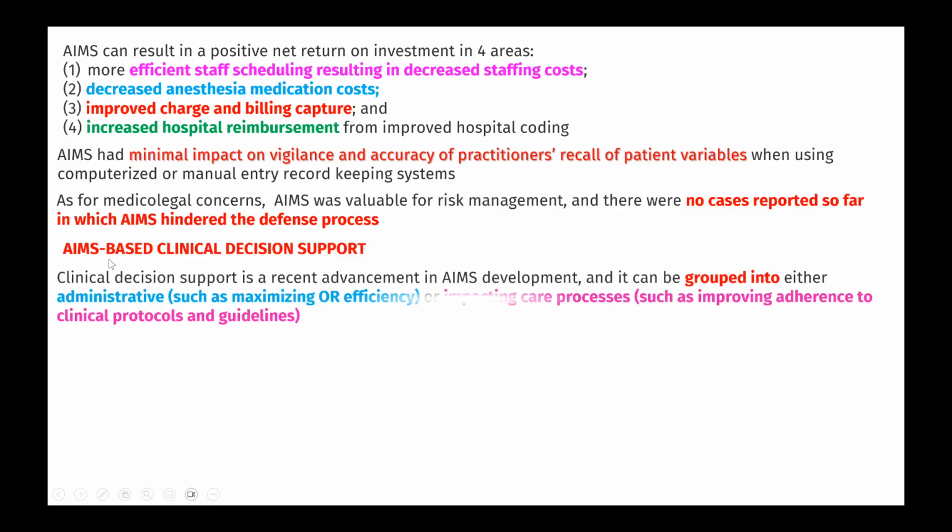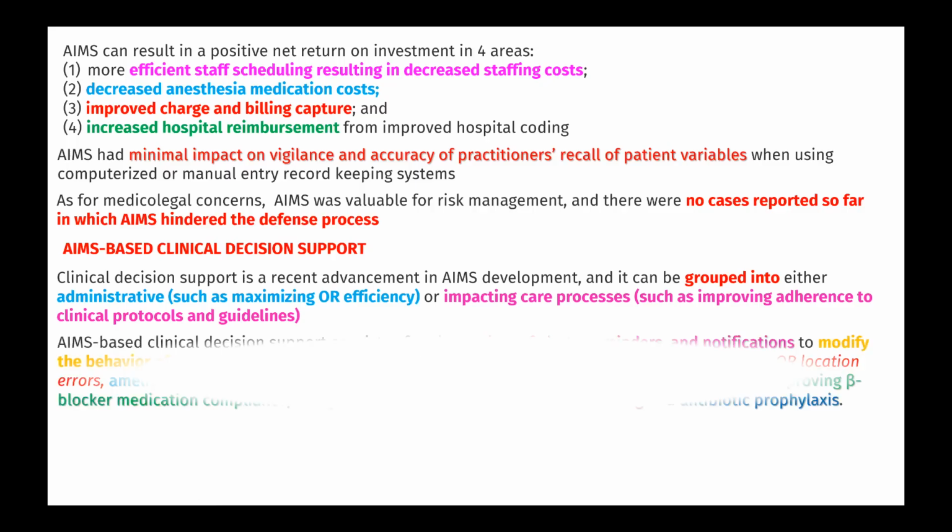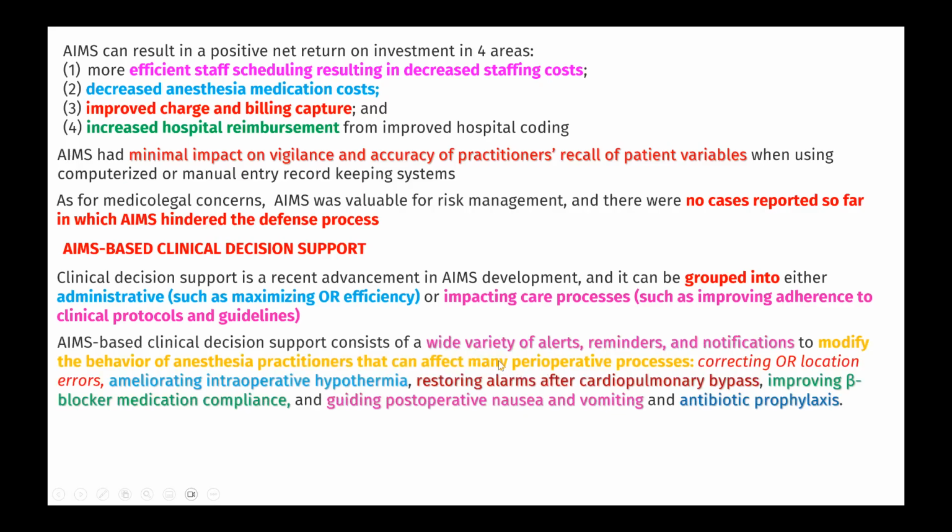So, AIMS-based clinical decision support. If you have this habit of recording all the patient's behavior, that can be used to improve the administration as well as improve patient safety by adhering to or creating protocols and guidelines so that the complication is not allowed to recur. So that is the advantage, and the variety of alarms, alerts, and reminders will help to modify the anesthesia practitioner's practice.